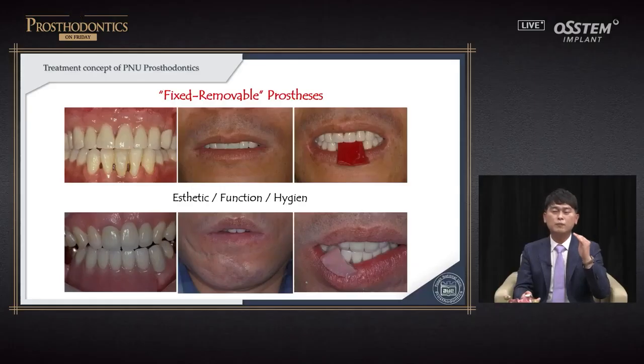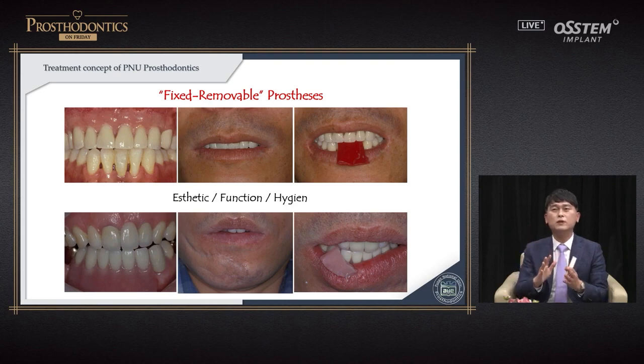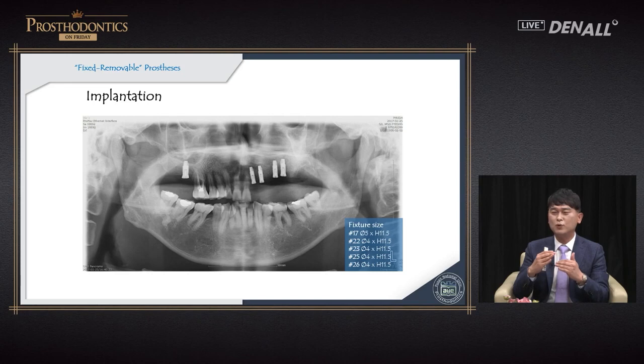Many dentists do excellent surgeries and treatment for patients who are very satisfied. However, inevitable complications can occur and the problems will go to the local private clinics as well in 5 years' time. So Professor Chung Chang-hoon's fixed removable prosthesis can come very useful, and we try to further advance on top of it. So we try to combine the fixed and the removable functions.